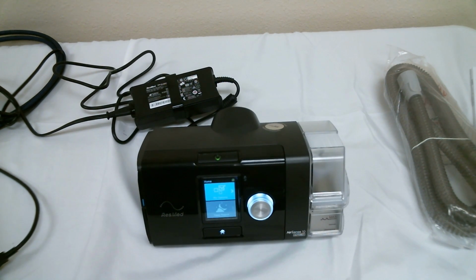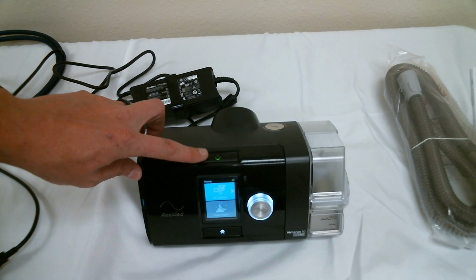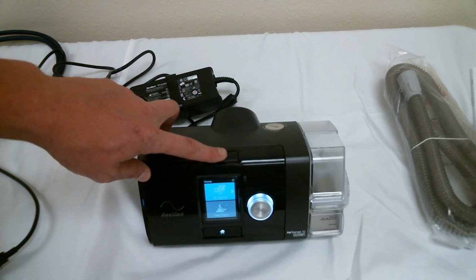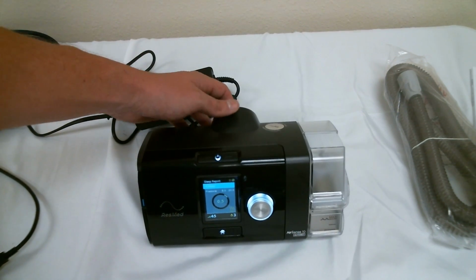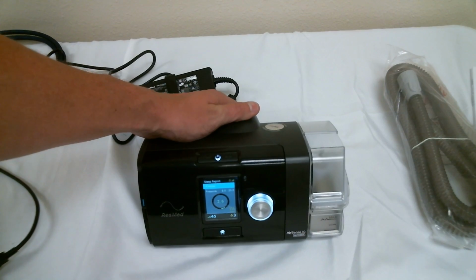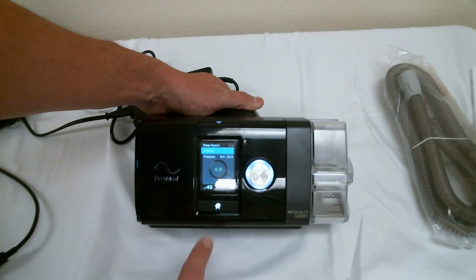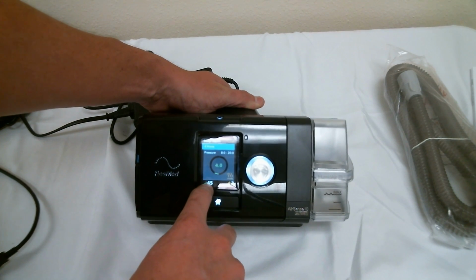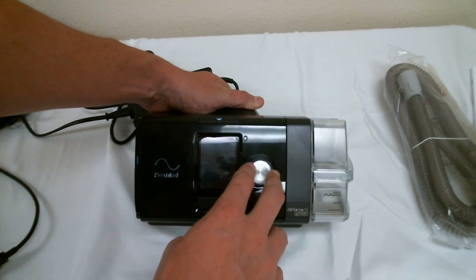Now that we have the device assembled and ready, let's go over the basic operation. The on and off button is located at the top of the device and is as simple as pressing to turn on, pressing again to turn off. When you first turn on your device, you will see your pressure setting prescribed by your doctor at the top, current pressure, ramp time, and humidity setting.